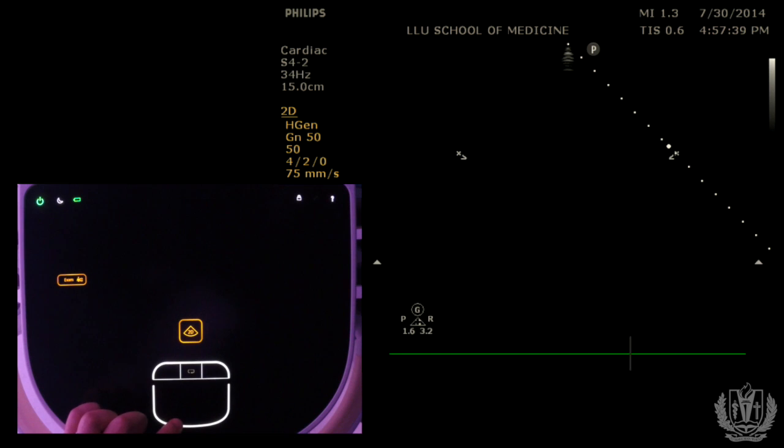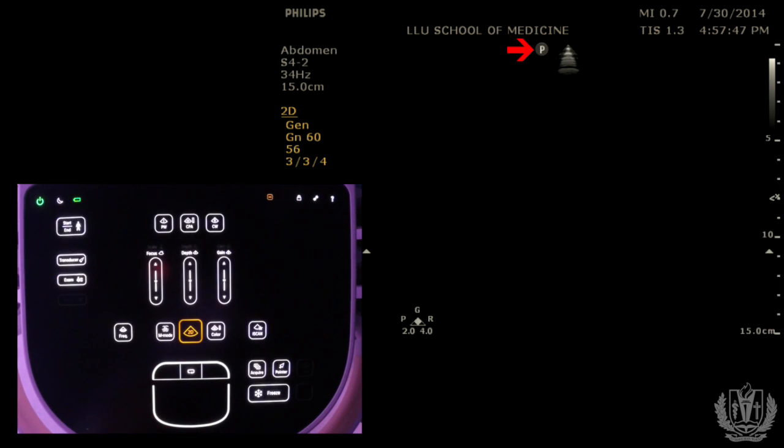One thing to note: by default, this machine goes to cardiac mode, and the indicator is on the right side of the screen — that's only for cardiac. If we switch to abdominal mode, you see that the indicator on the screen switches to the left side, where the P marker is. Make sure you are on the correct mode before you start scanning, or you won't get your optimal images.